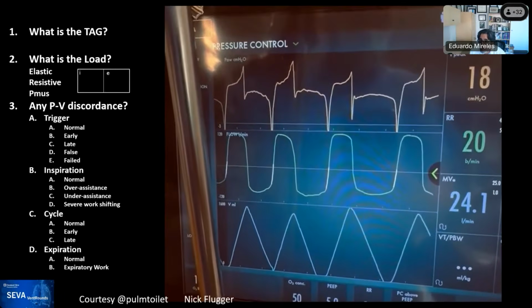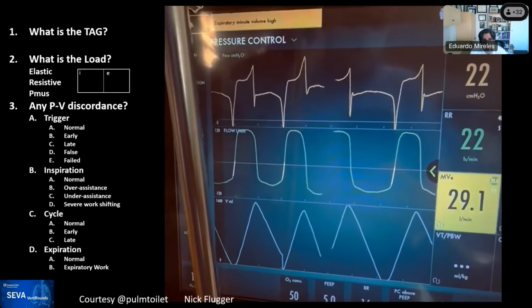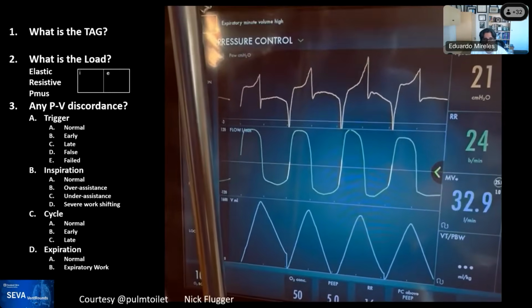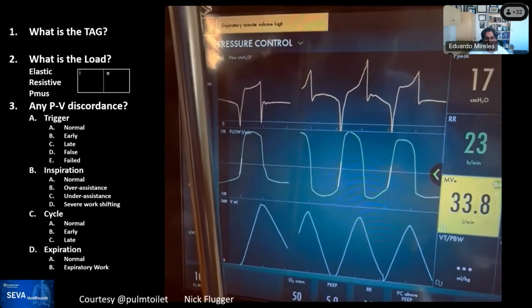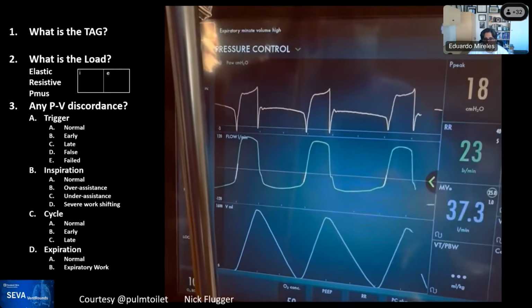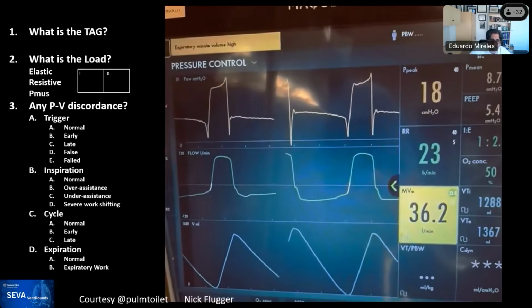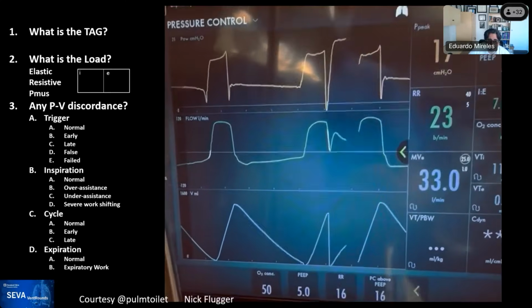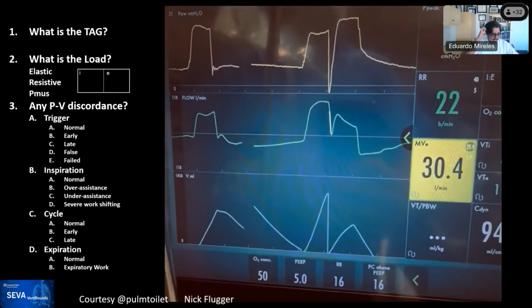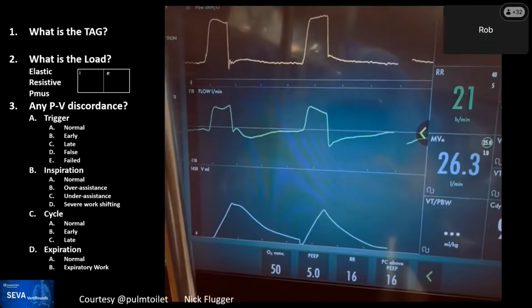There is another question here for NAVA, and I don't know if NAVA would completely suppress this. I know that we do that for periodic breathing from over assistance, but I don't know if with Cheyne Stokes from brain injury or from heart failure, it would just behave the same way. Rob, thoughts? The problem with NAVA is when they go apneic, you'll get an alarm. Yeah. And that won't happen in auto mode.